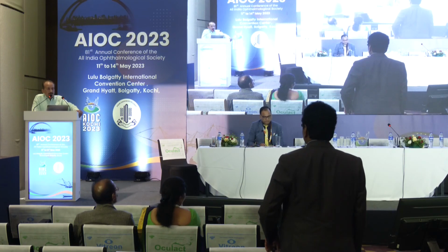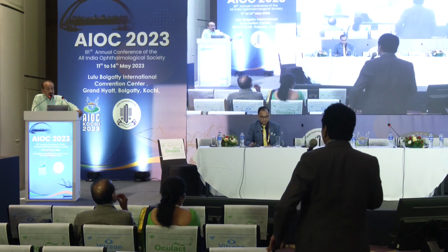True. Thank you, Professor. Yeah, post RK actually, because your cornea is completely distorted, and secondly, your IOL power calculation is not so accurate most of the time. This particular patient landed up with almost +5 diopter post-operatively, and then we had to do the complete recalculation. The calculation itself is a challenge.